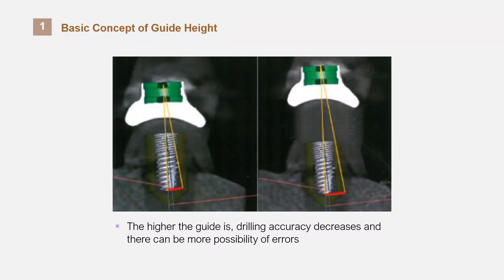If the guide is tall, the patient needs to open the mouth wider during the procedure, which is very painful, and it will also make drilling more difficult. Even for the convenience of the surgery, height of the surgical guides needs to be designed as low as possible.